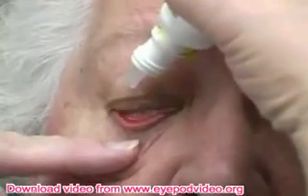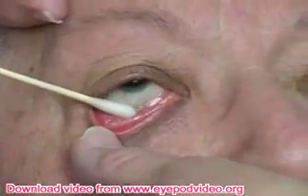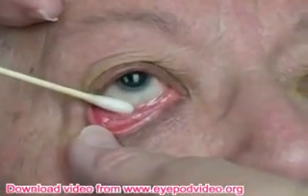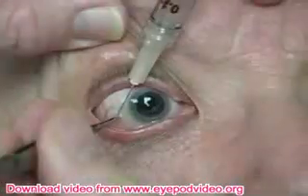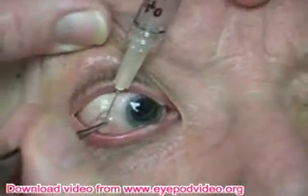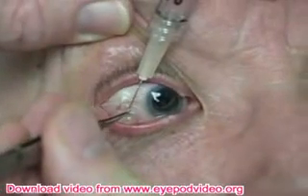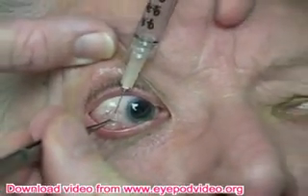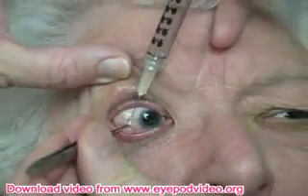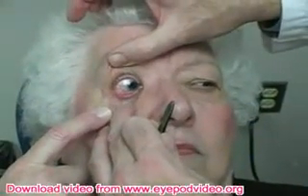First we just put regular topical eye drops in the eye and then add some 4% lidocaine inferior temporally at our injection site. I like to use toothed forceps to elevate the conjunctiva and then inject subconjunctival xylocaine.